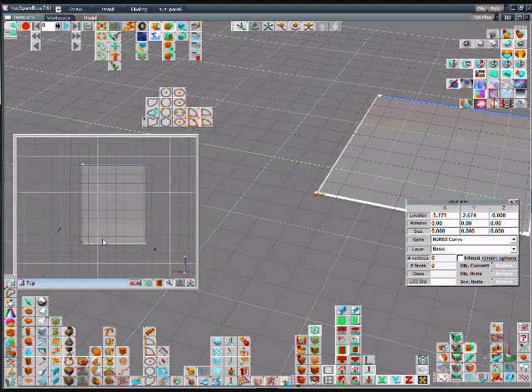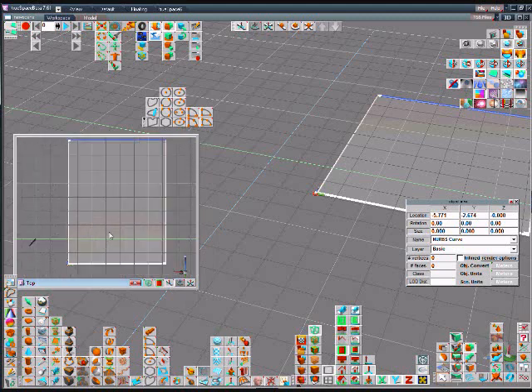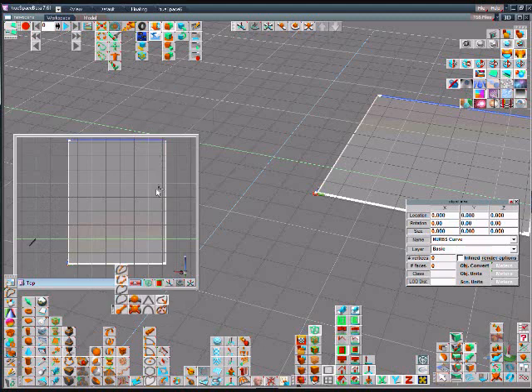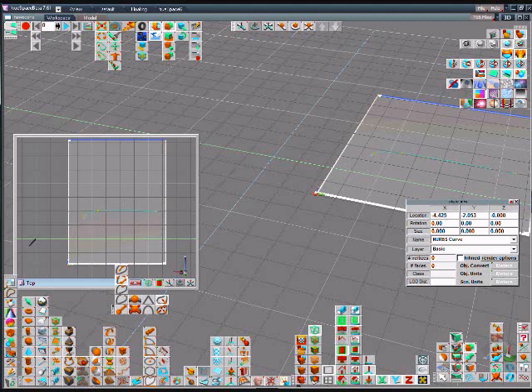Choose polyline and begin by making an outline of the shape of the finger splint that we'd like to make.